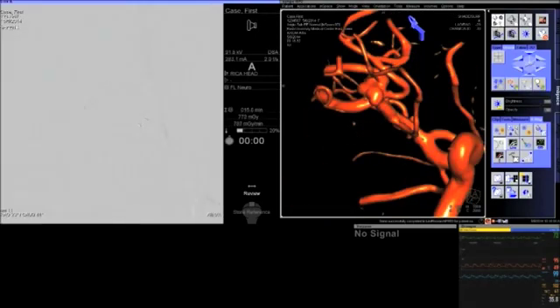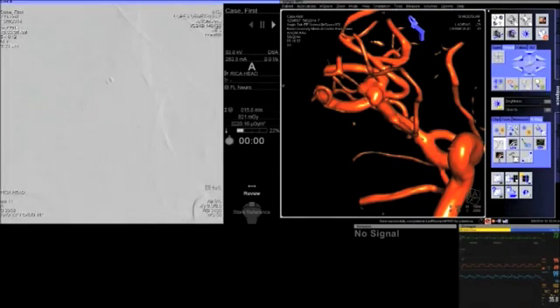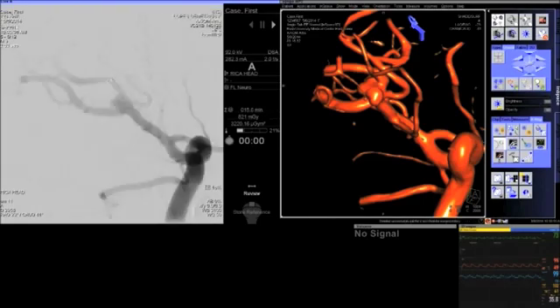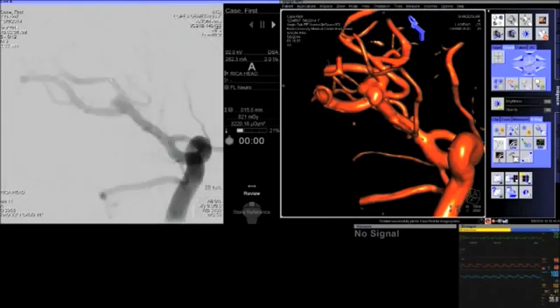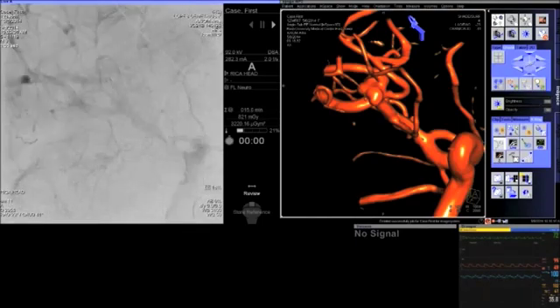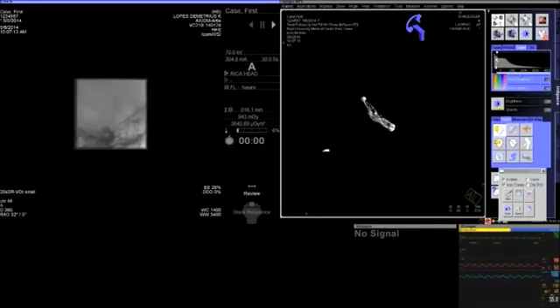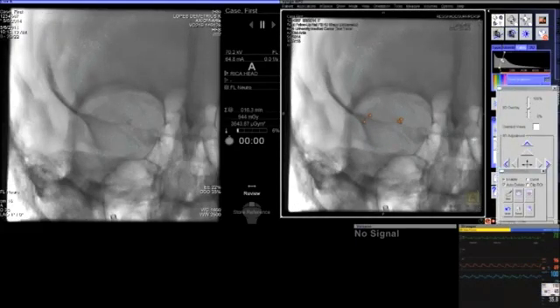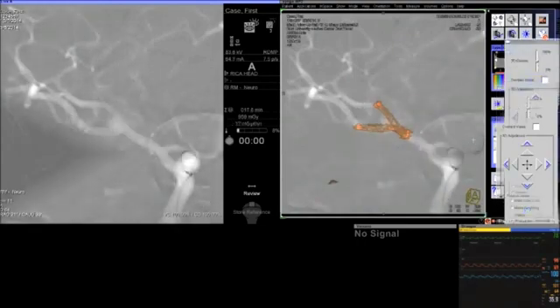And I think what's been very helpful to us is to obtain now a new acquisition using the Siemens DynaCT VOI technique, which is a collimation from top to bottom and side to side to decrease the dose of radiation that we do in this next spin. This type of acquisition will allow us then to form a model of the stents that were deployed. So you're not doing a virtual stent, you're actually using the real Y stent construct to then overlay in your anatomy as you advance a microcatheter through the Y stent to get access to the aneurysm.